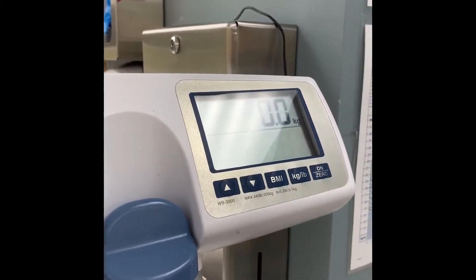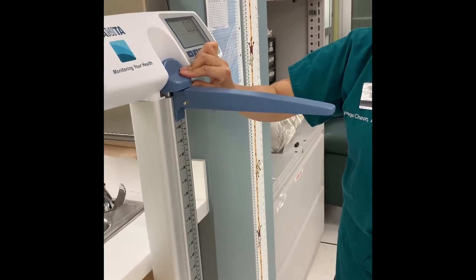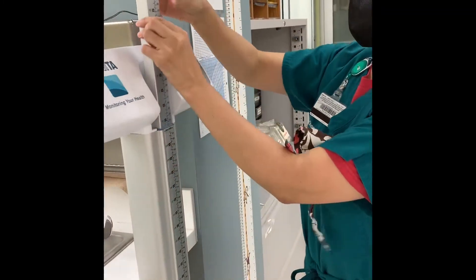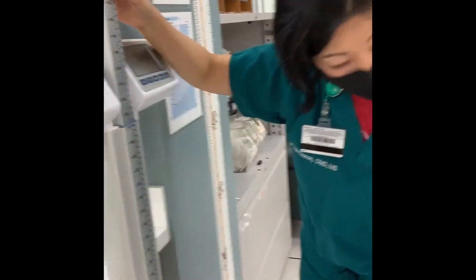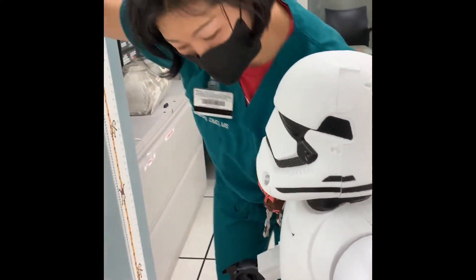I'm going to set height. Because Storm is pretty tall. I'm going to set this up. Hey Storm, do you want to step on here? Okay, let's measure your weight.